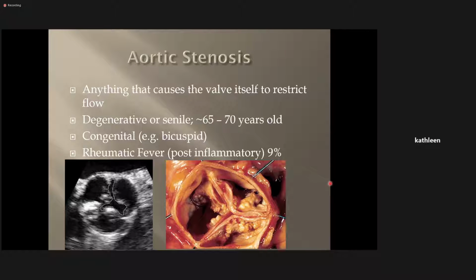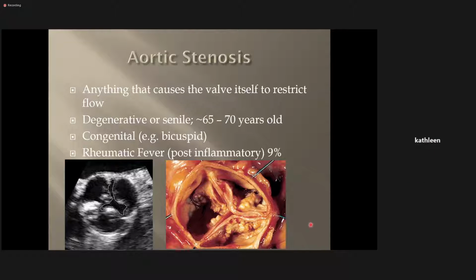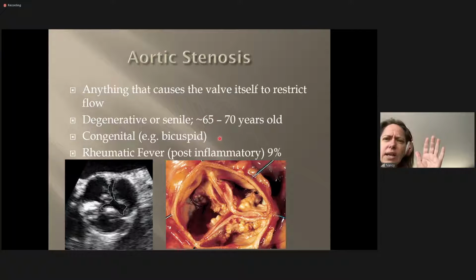What view is the 2D image? That should be your parasternal short axis. It might be a little off axis on the side, but they're just looking at the opening of the valve. This is 2D, and they've just traced it with a planimetry measurement to get an area.